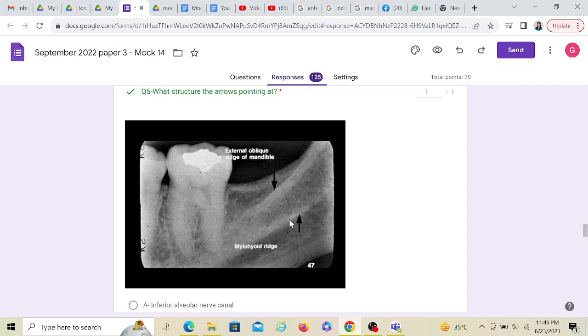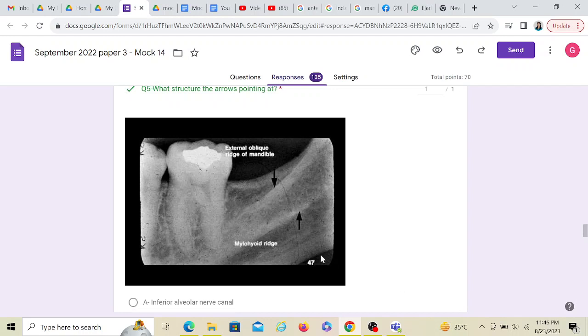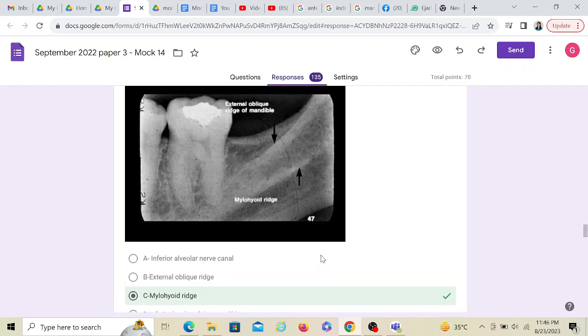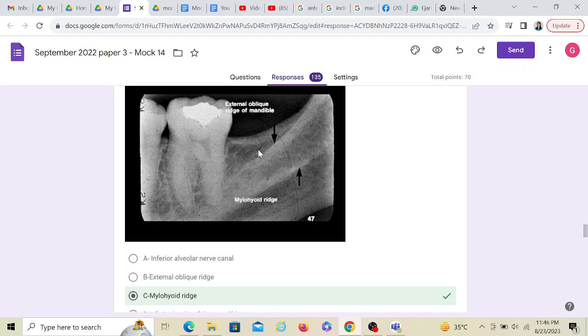Two arrows are pointing. In an exam, any one of the arrows can be given to you. If I see this arrow, this is mylohyoid ridge. If in exam this arrow is given, it's external oblique ridge. If the arrow was pointing here, it would be inferior alveolar nerve canal. If the arrow was pointing here, it would be inferior border of the mandible. You are expected to know these landmarks. I'm sure in your anatomy classes and in BDS1, if not in BDS1, definitely in your clinical postings in oral surgery, they would have handed you a mandible and you would have touched and palpated the coronoid process, the condyle, the external oblique ridge.